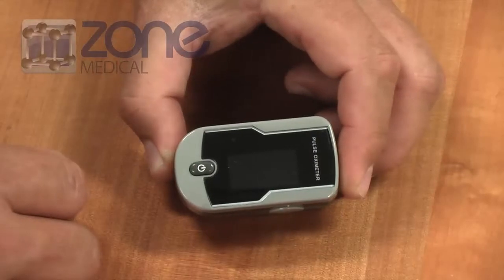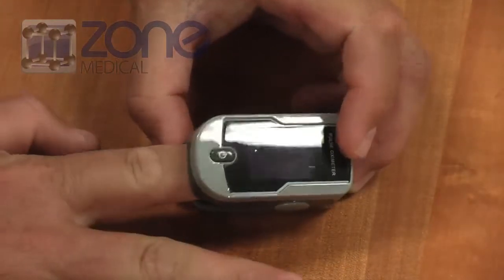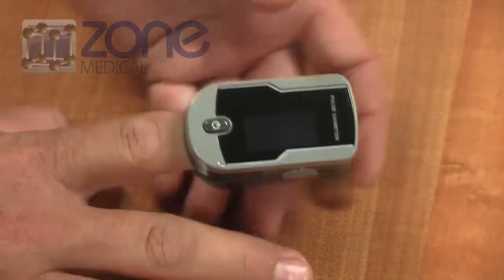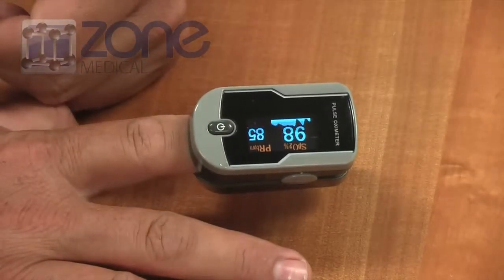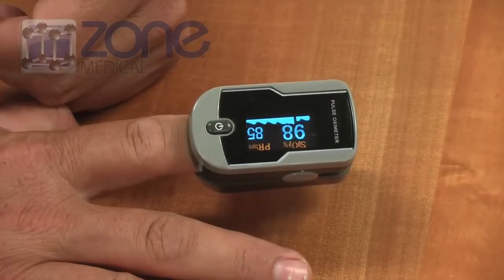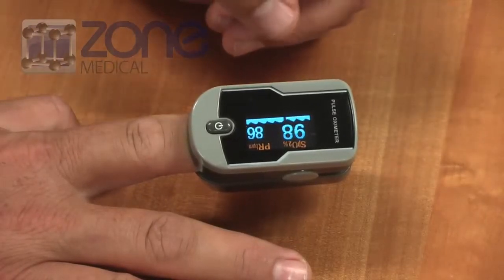This is the C21 finger pulse oximeter, the adult model. They also make a child model called the C54. Very easy to use. Place it on the patient's finger, press the button, and within a few seconds you'll have an average reading for SPO2 and your pulse rate, as well as a PLETH graph.